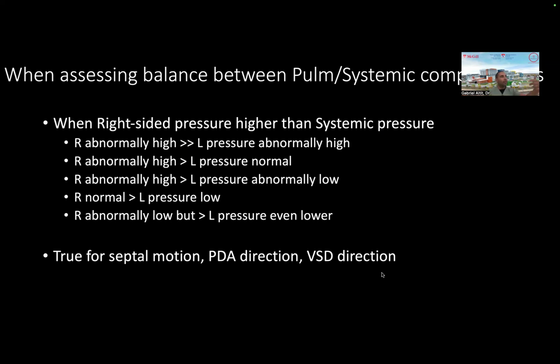And that's why when we did the echo, I asked, what's the blood pressure of the patient? Because if he was hypotensive with poor output from an LV, I'd say this is a kid I want epi, this is a kid I want dobutamine. But if the kid is hypertensive already, I don't want to give something that's going to increase the SVR, when the LV is already struggling. So that's why milrinone is an option in that patient, because I want the SVR to go down.